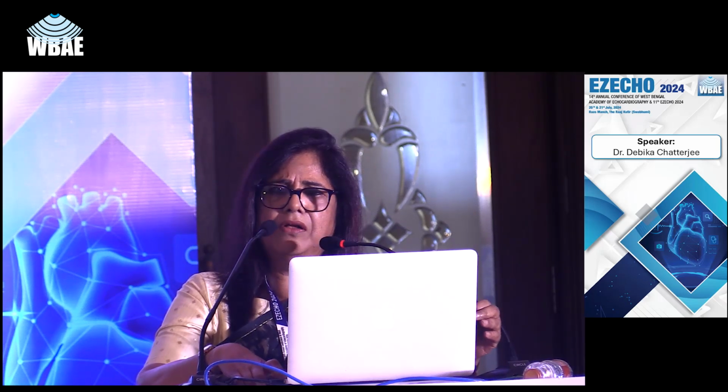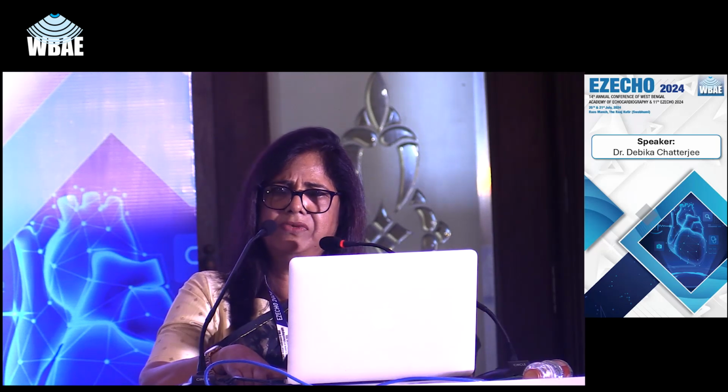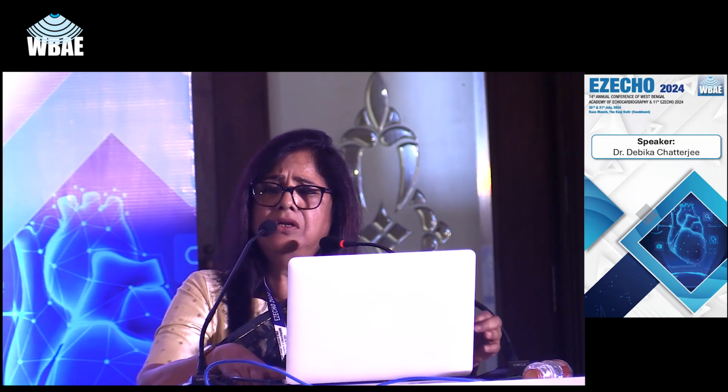Now, another hemodynamic parameter which is very useful in the CCU is the LV filling pressure. A lot of discussions have already taken place. Elevated LV filling pressure is the cause of shortness of breath in diastolic heart failure, and it is measured quickly in the echo by measuring the E by E prime.